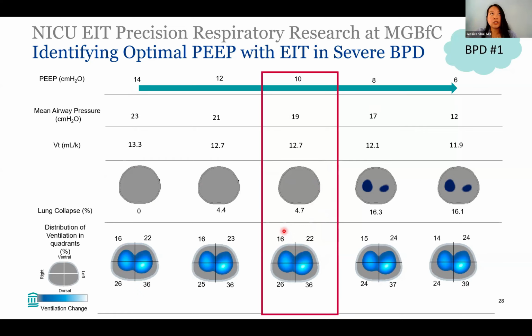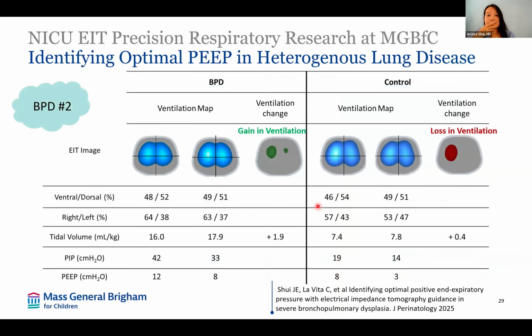And the oxygenation improved. The FiO2 went from a baseline of around 45-50% to, when put on the lower PEEP of 10, around 30-35%, I believe. So clinically that matched, he liked that setting.